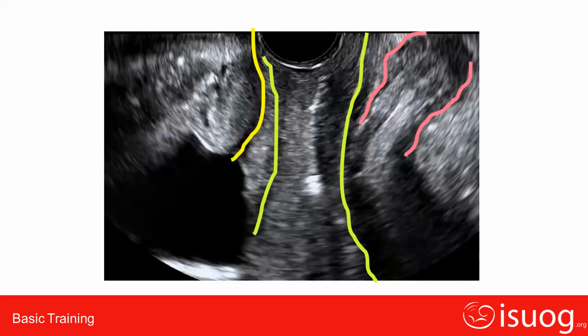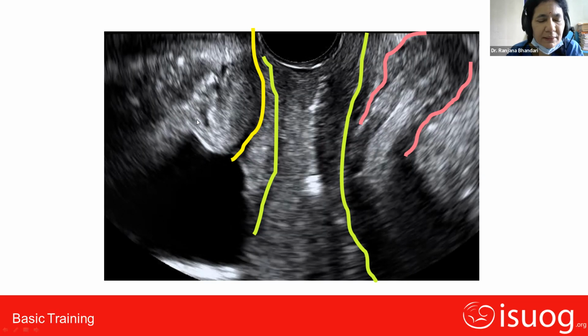See, this is the most important slide for transvaginal scanning, and this should be imprinted in our mind. In all transvaginal scanning, as madam had told in the last session, there are three things that are very, very important. One is optimization. Second is how to see it properly, orientation. And third is systematic examination. Systematic examination we will study in the lower part of the PPT. The optimization was already told by our Dr. Hasmukh Lal sir very nicely, that is how the depth is important, how the zoom is important.